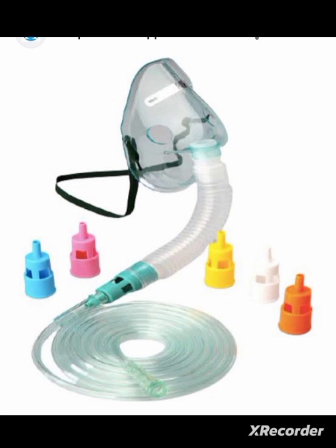For example, we can give O2 concentrations of 24%, 28%, 31%, 35%, 40%, 50%, etc. So the oxygen delivery can be varied along with these conical shaped devices, and we can give high flow and precise O2 concentration to the patient, and manage the flow rate along with these devices. It is very useful for the patient.